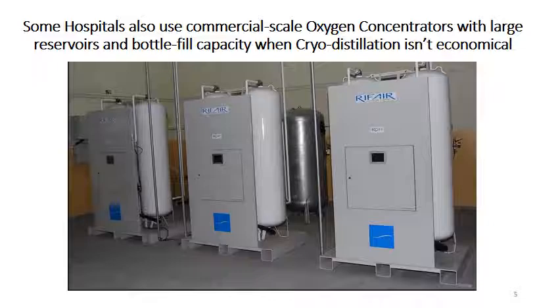So when we talk about low-cost, effective alternatives to oxygen distillation, oxygen concentrators are not limited to small portable units. There are industrial-sized ones which operate on the same principle that can supply an entire hospital's oxygen needs. And they also are used to create pressurized tanks of oxygen. So in the event of electrical power failures.